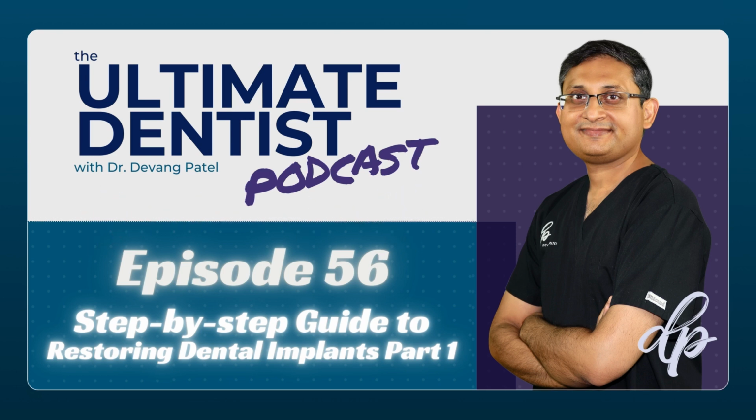Number 3, you need to assess the patient's smile line. It's really, really important, especially with the anterior teeth, but also the posterior teeth. So always ask the patient to grin. Make sure they move their lip up and see how far the lip goes up, and have some jokes ready to make them smile.